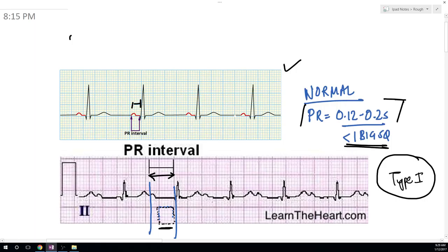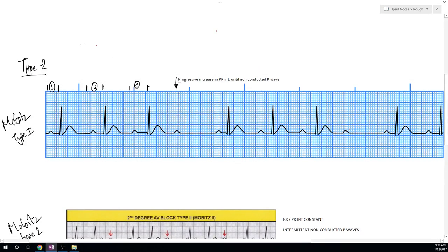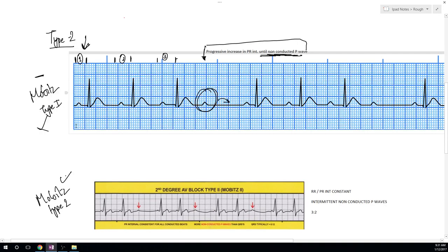In Mobitz type 1, we have progressively increase in the PR interval until there is a P wave which is not conducted. So here as you can see, first the PR interval is this much, here it's increased, here it's more increased compared to the previous ones, and then there is an isolated P wave which is not conducted. That is type 1.